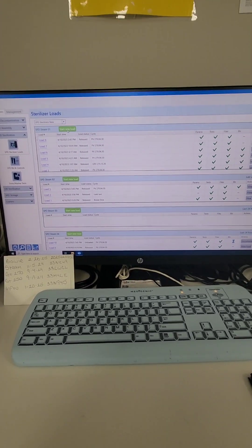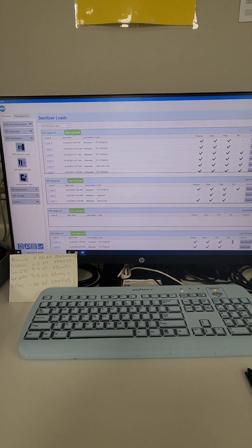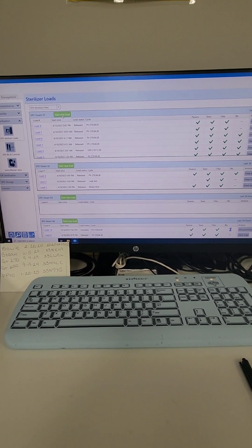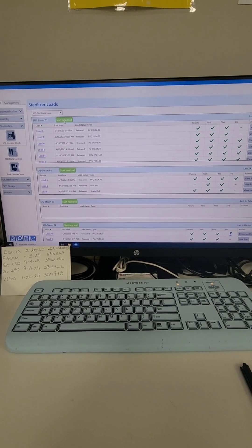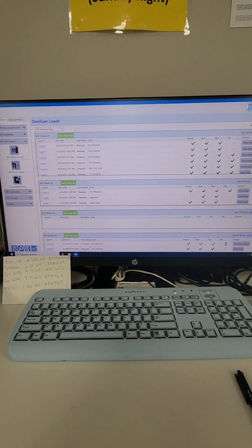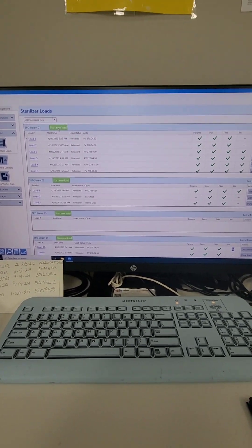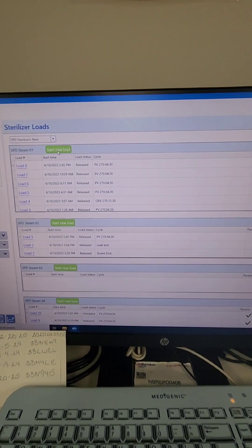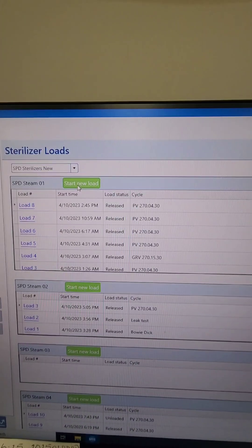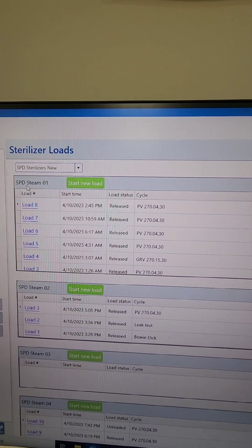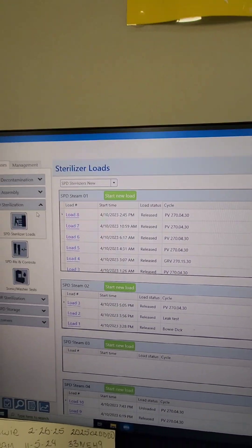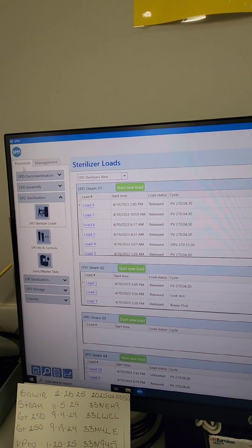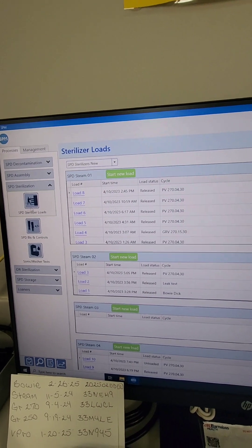What's going on guys, welcome back to WDYD CSP — What Do You Do as a Central Sterile Processor. Let me walk you through building a load in your electronic system. We're going to go into sterilizer number one here.